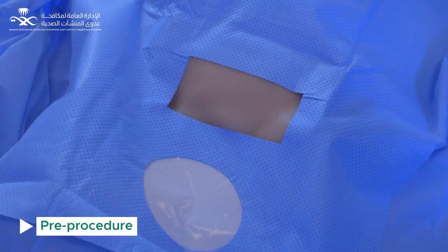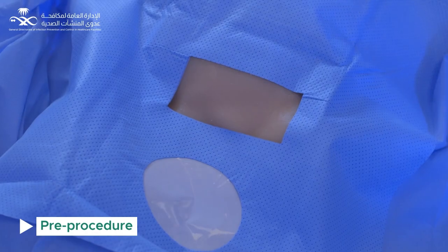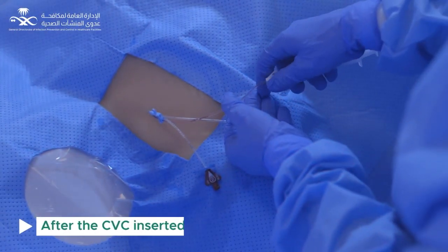Afterwards, flush all lumens of the line, clamp all lumens except the Seldinger port. Patient is ready for central line insertion, and try to use minimum number of lumens. After the central line is inserted.